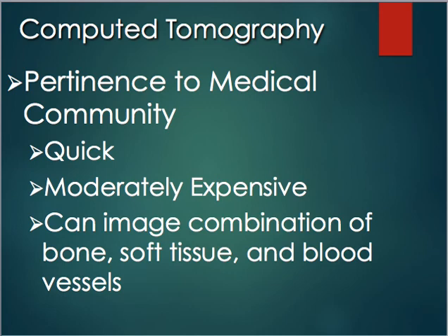This is a testament to what a huge impact CT technology has in sparing the patients from improper diagnosis or unnecessary surgeries. And it also is huge with getting urgent treatment faster. I mean, one of the biggest things with strokes is we need to act fast. We need to know what's going on fast and diagnose it so that we can help treat this patient and eliminate some of the permanent damage. So CT is instrumental in getting that quick diagnosis for a stroke.